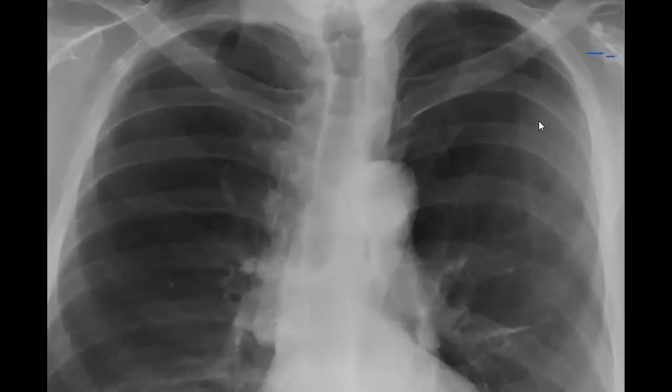You have your checklist. You are going to check multiple Bs. One of them will be the first one, the pneumothorax. So is it right or left pneumothorax? Exactly. This is the pleural line here.